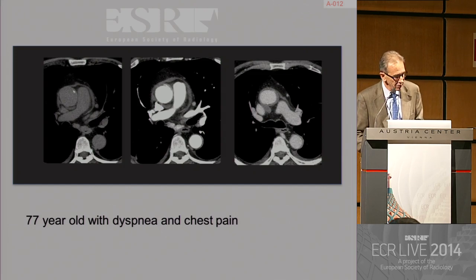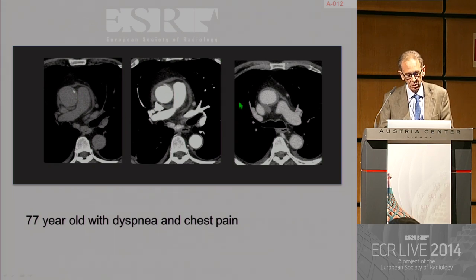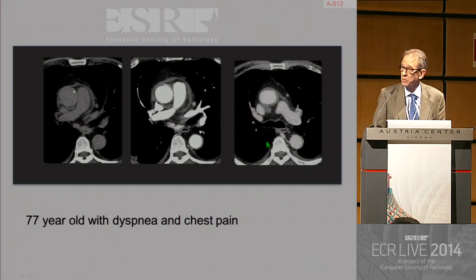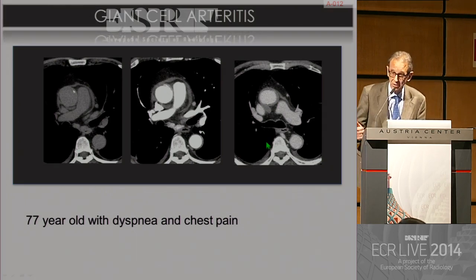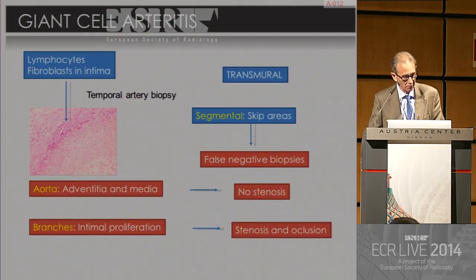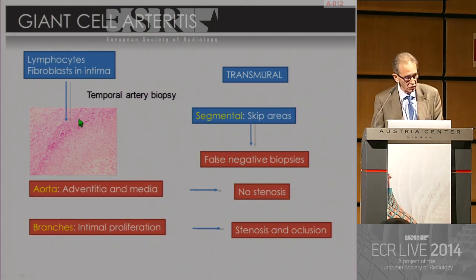Here is a 77-year-old patient with dyspnea and chest pain. We are seeing wall thickening and enhancement of the arterial wall in the late phase. This cannot be Takayasu because she's 77 years old — this is giant cell arteritis for that reason, and also because it is a more common disease. Giant cell arteritis is pathologically very similar to Takayasu.